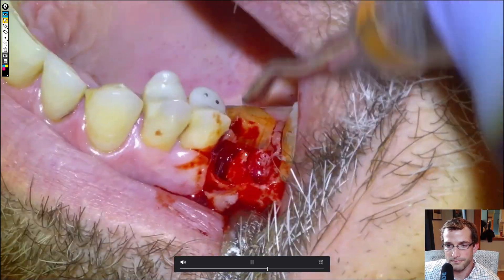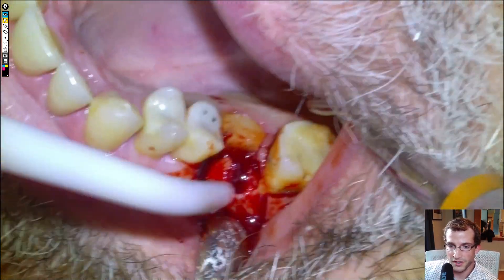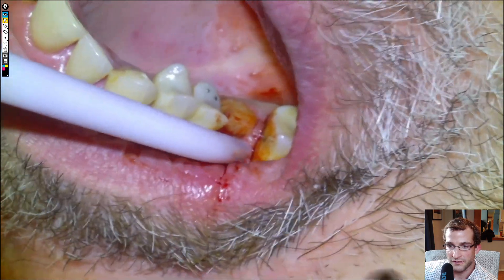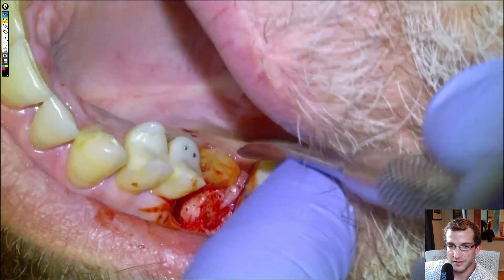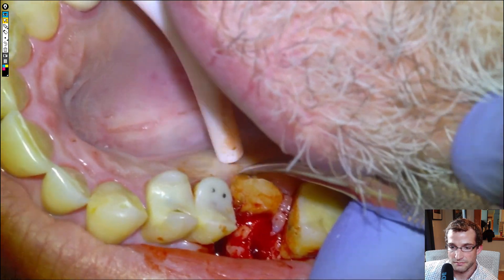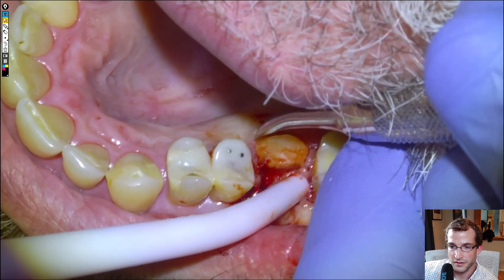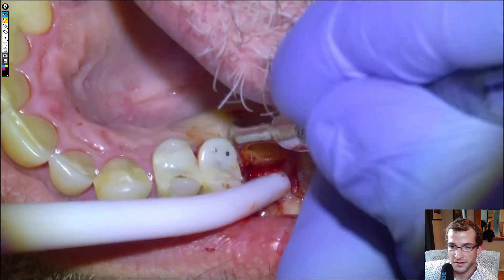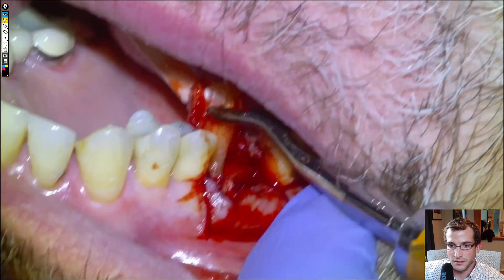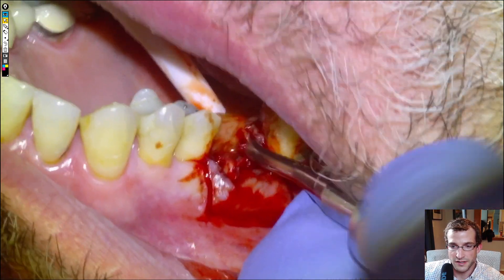Then we'll remove the palatal root, which is obviously the biggest root and the most well anchored. We try not to touch the 5 and the 7 because of the large restorations. We'll see if we can't get some luxation on it with a periosteal. We probably could have grabbed a root tip forcep for this one — that would have worked just as well — but we'll grab an elevator and just lift it up.